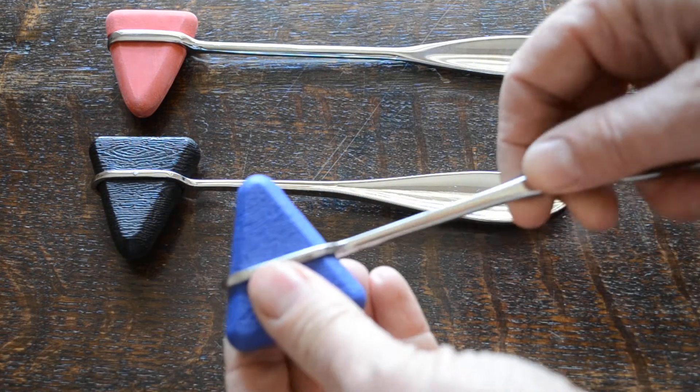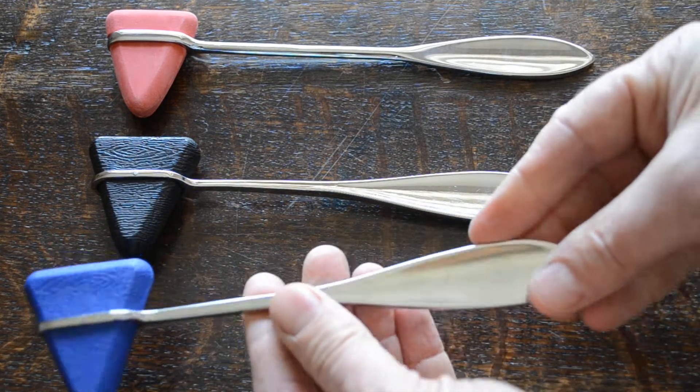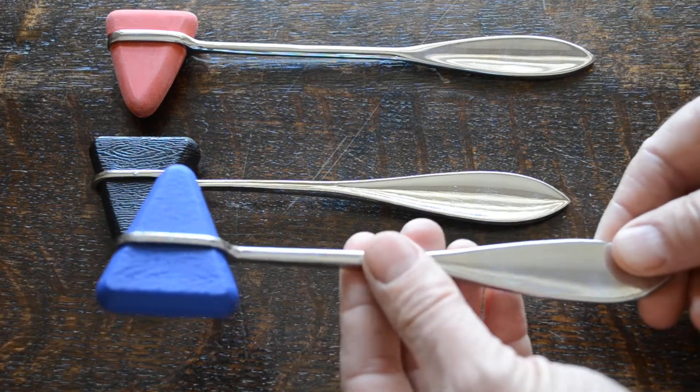Now the various features on these are they've both got flat steel handles, good quality surgical steel, it's a polished steel finish.